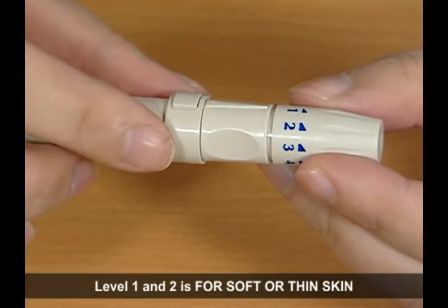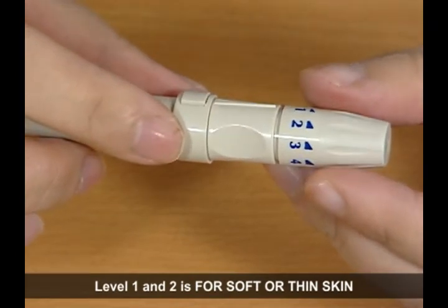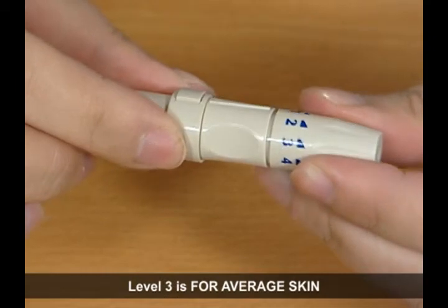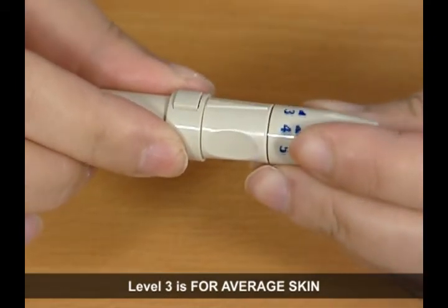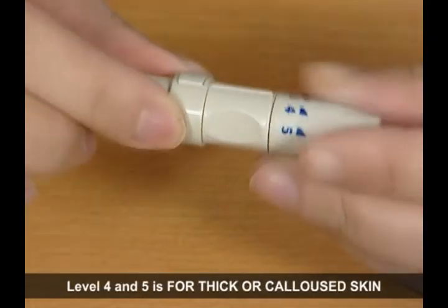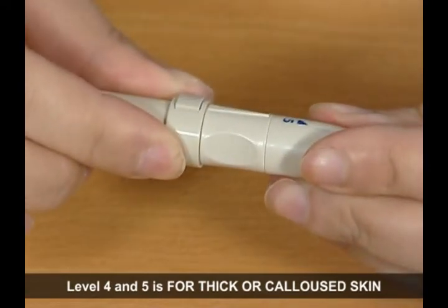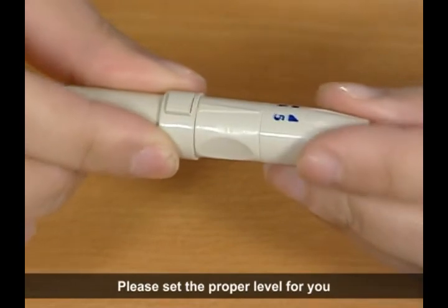Level 1 and 2 is for soft or thin skin. Level 3 is for average skin. Level 4 and 5 is for thick or calloused skin. Please set the proper level for you.